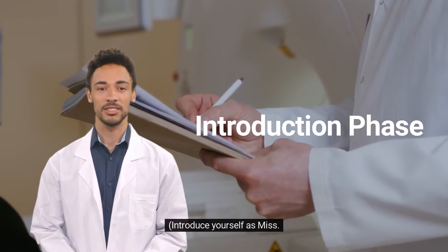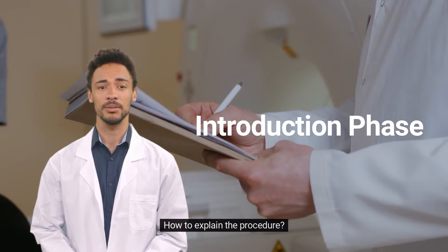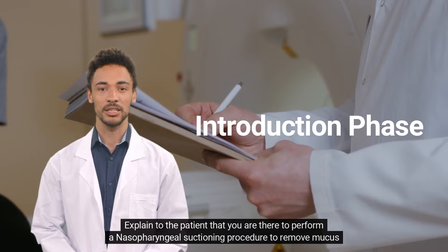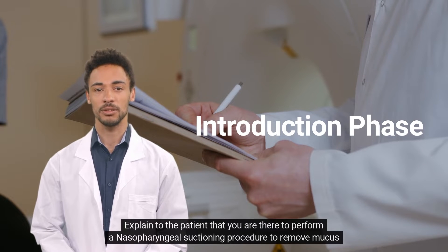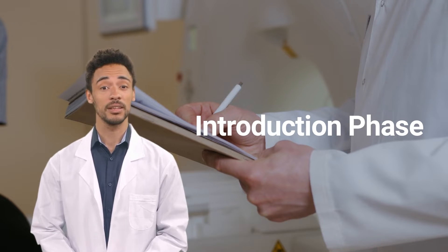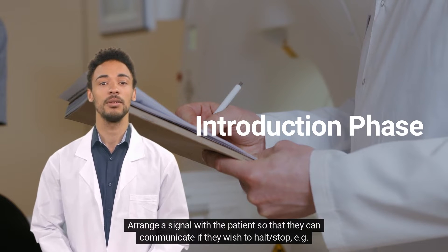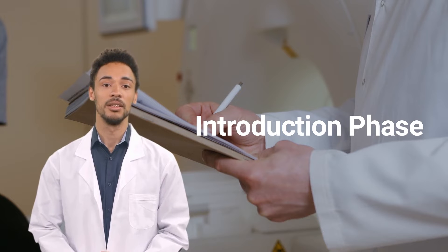Introduce yourself as Miss X, the nurse caring for the patient today. Explain to the patient that you are there to perform a nasopharyngeal suctioning procedure to remove mucus or saliva from the back of the throat, so that the patient can cough or swallow better. Arrange a signal with the patient so they can communicate if they wish to halt or stop — for example, raising their hand.